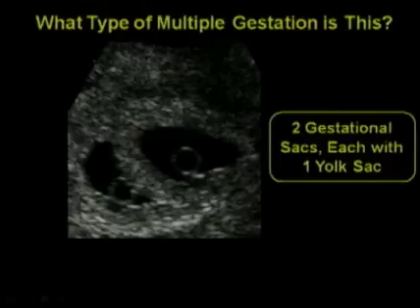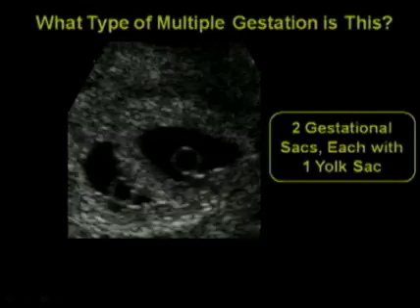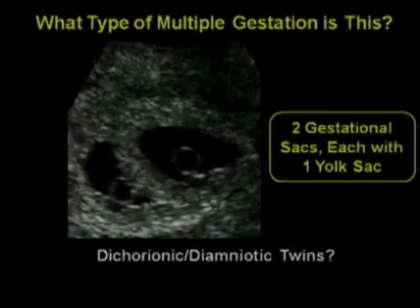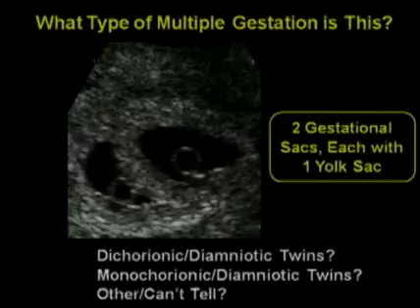Before we go any further, I'll pose a little problem case, and the answer will come up in a few minutes. This is a transvaginal close-up view of a multiple gestation at about five and a half weeks. The question is: what type of multiple gestation is it? You can see two gestational sacs, each with one yolk sac. Are these dichorionic-diamniotic twins, monochorionic-diamniotic twins, or something else — or you just can't tell? Keep this in mind; we'll see the answer very shortly.